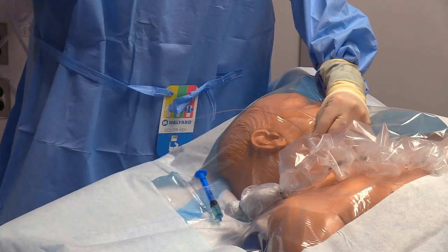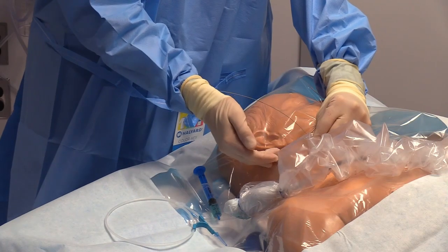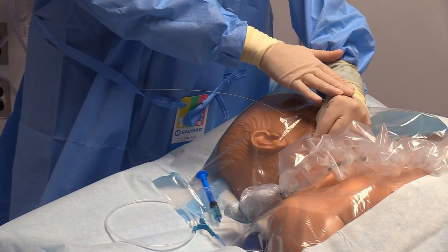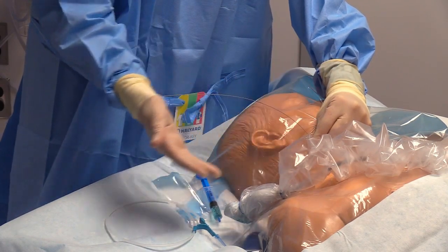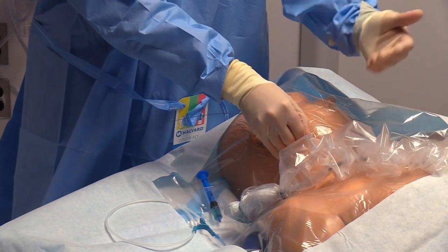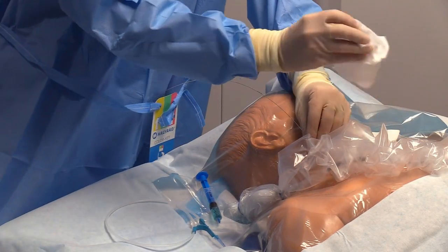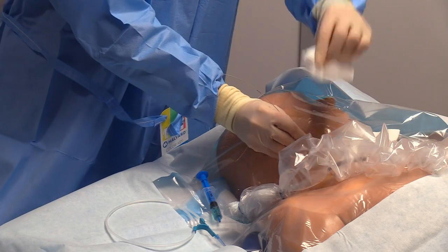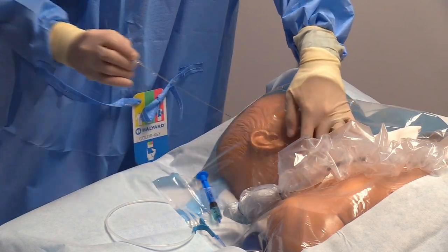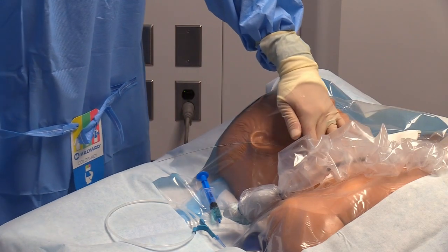Once I do that, this piece is going to come off. My right hand is going to grab the needle from my left hand, which has been stable this whole time. If the patient had moved their head, my hand would be very stable with where the needle is. My right hand will grab the needle. If I have a 4x4 here, which I would have liked to have put up beforehand, I would take the 4x4 over where the needle is going to come out and hold a little pressure in case there's bleeding. And then take the needle out and place it in the safety bin there.